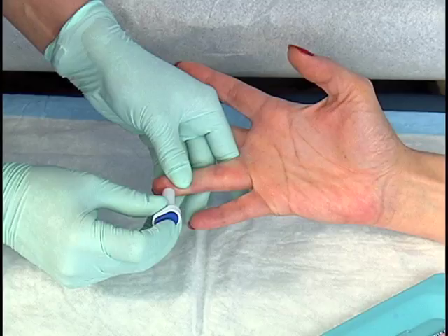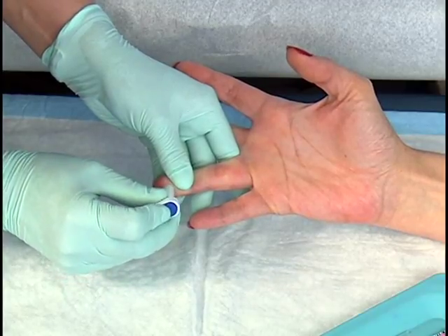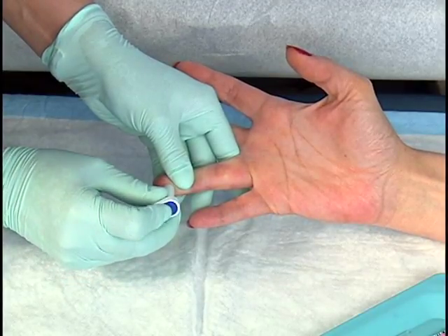Puncturing the side of the finger can cause the Lancet to penetrate the bone. Tell the patient she will feel a small stick. Firmly depress the activation button without moving the Lancet or fingertip until an audible click is heard. This causes the Lancet to puncture the skin and then retract into its plastic casing. Moving the Lancet or finger too soon can lead to an inadequate puncture and poor blood flow.